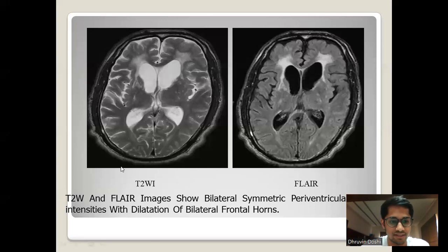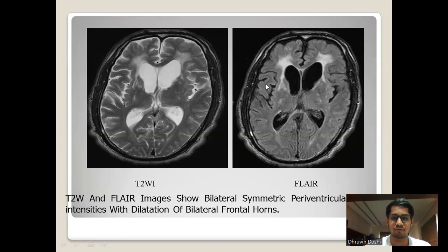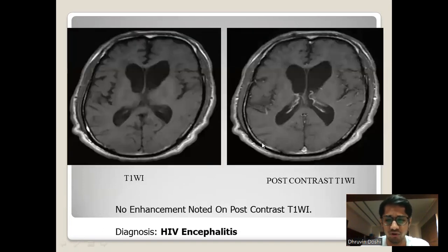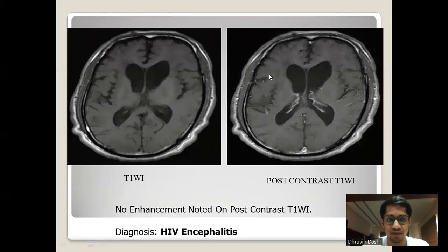On MRI, T2 and FLAIR images show bilateral symmetrical periventricular hyperintensities with some dilatation of the bilateral frontal horns of the lateral ventricles. On pre-contrast and post-contrast T1, no enhancement is noted. With the given history and MR findings, the diagnosis is HIV encephalitis.